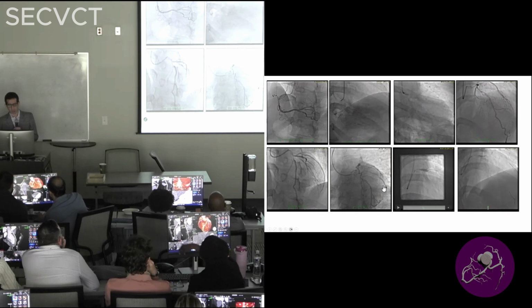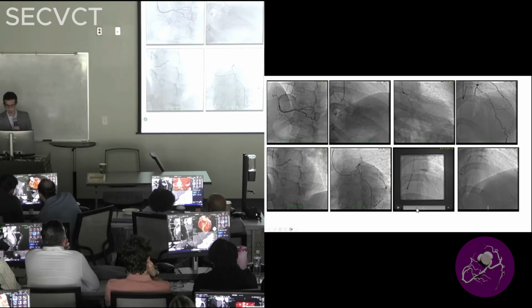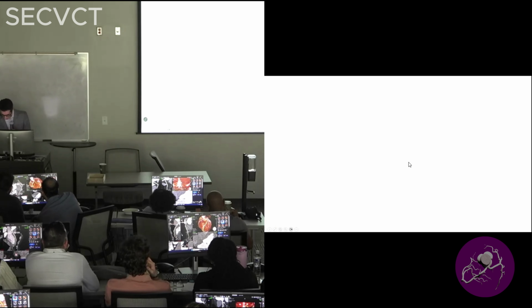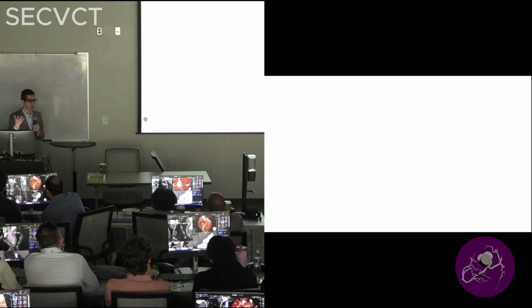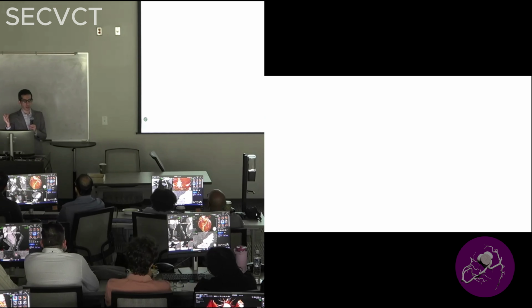Just to put a concept here: the power of 0, as I always say, does not apply to certain patients. We have to keep that in mind, the calcium score or the absence of calcification on prior cross-sectional CT. So the teaching point here is that when you have patients with diabetes, patients with smoking history, patients with FH, familial hypercholesterolemia, things that suggest a really strong family history, where you have not done the homework for the FH, be careful of the absence of calcium in the previous calcium score or chest CT to say there's a very low chance of having obstructive or some form of coronary artery disease.